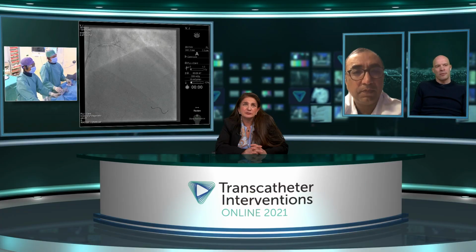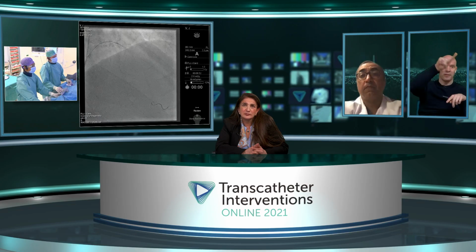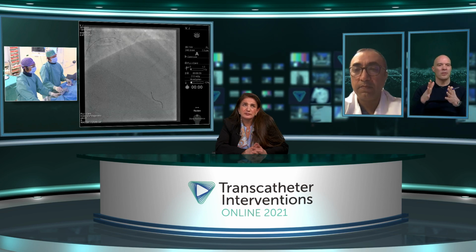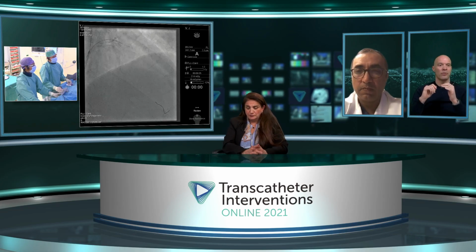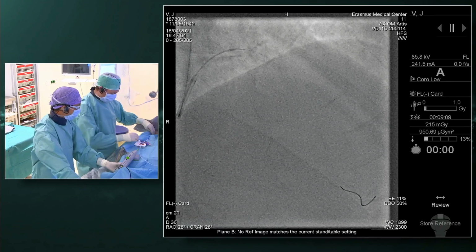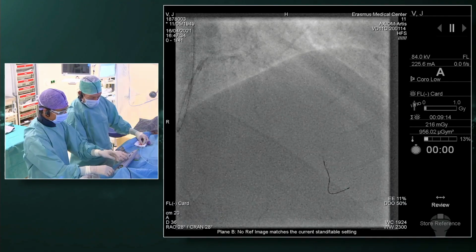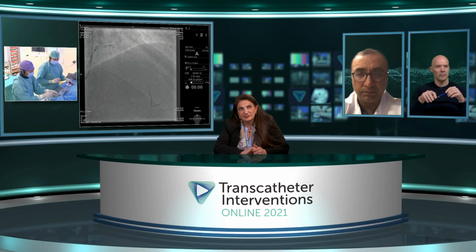I think an important difference with rotational atherectomy is also that because it's an orbit, it turns around in the vessel, blood is still flowing through. And this is different from rotational atherectomy, where you completely obstruct the vessel in principle and there is no forward flow. And of course, there might be a higher likelihood of microvascular issues afterwards. So I think during a procedure like this, as you are spinning or sanding, if you would give contrast, the contrast would really go all the way down in the vessel.